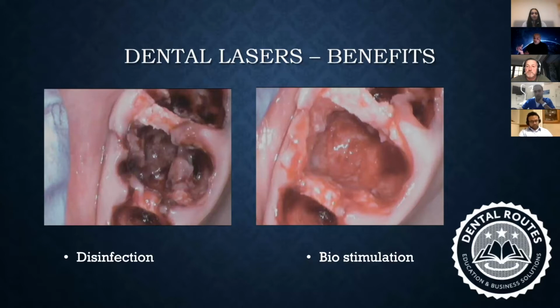So that way you are 100% sure that there is no granulation tissue left within the crevices of your bone. And you can never achieve that level of disinfection and complete sweep of all the granulation tissue by using traditional curettage or any other methodology. At least in my hands, it's absolutely not possible.